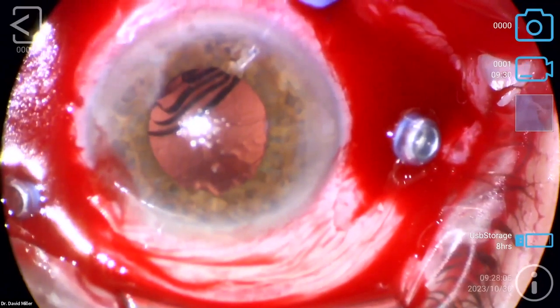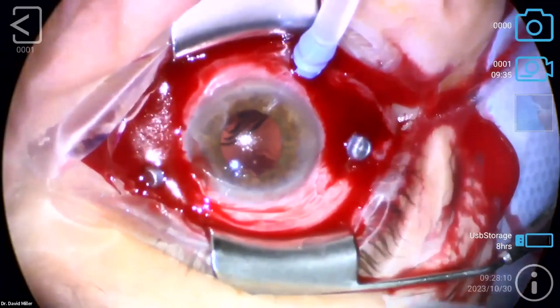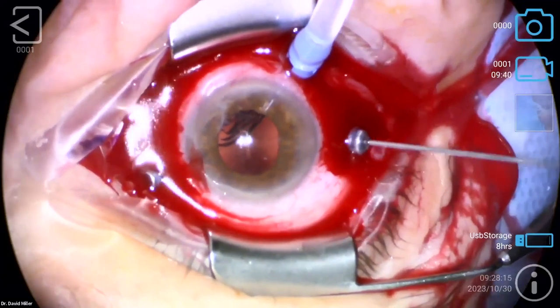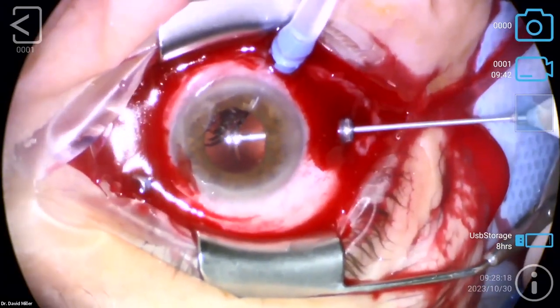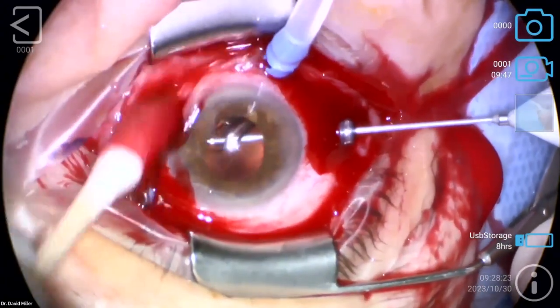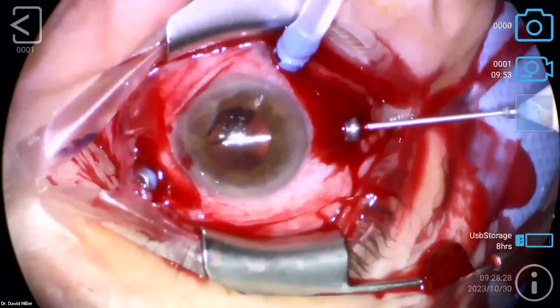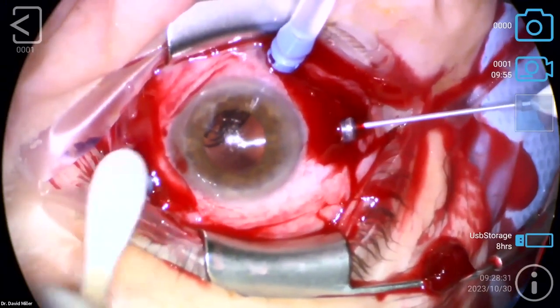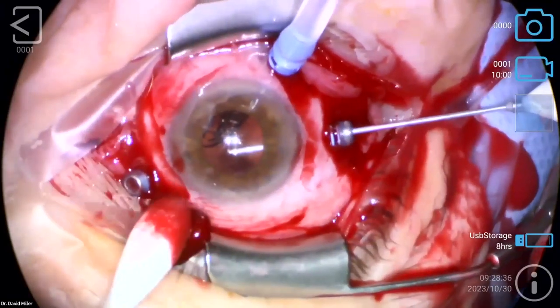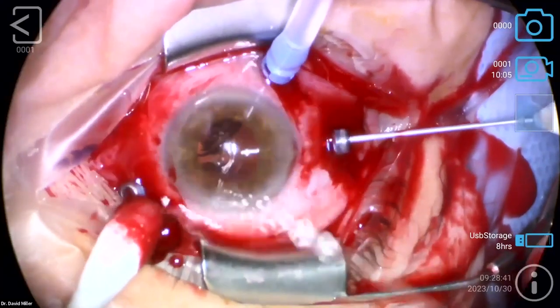Whoops. Let's get that over there. Give us a splash on the cornea there. And who has a Q-tip for all that? Just going to grab some of this out of there. It's Halloween, so this kind of fits. A little extra. There we go. So, give me a splash on the cornea again. Take some of that off. There you go.